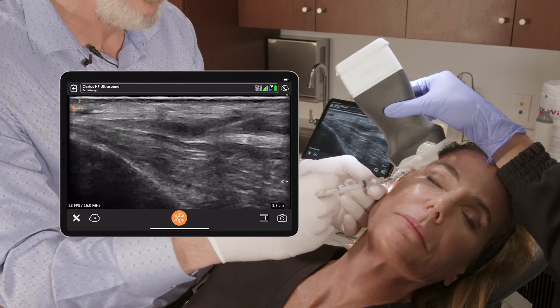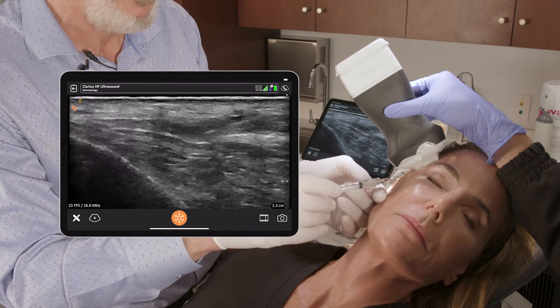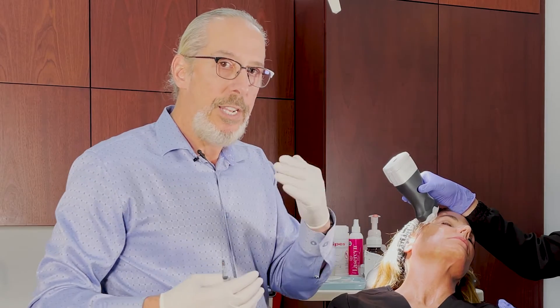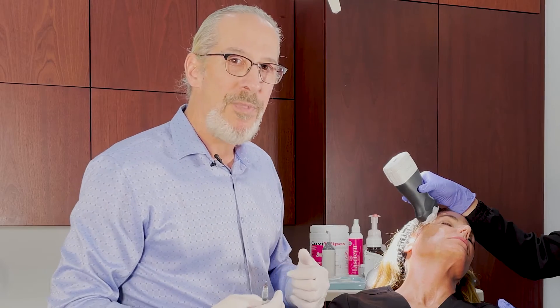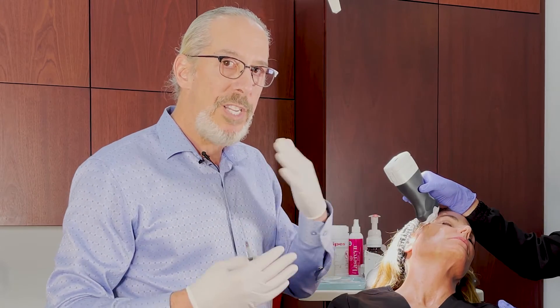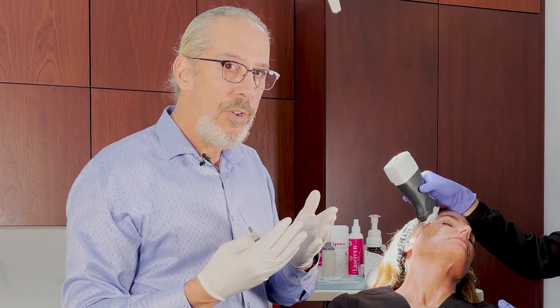That demonstrates the proper position for temple filler in that space between the SMAZ and the deep temporal fascia. I also want to point out that I'm using sterile ultrasound gel and Tegaderm — this sterile plastic coating on the tip of the Clarius ultrasound — so this is completely done sterile.